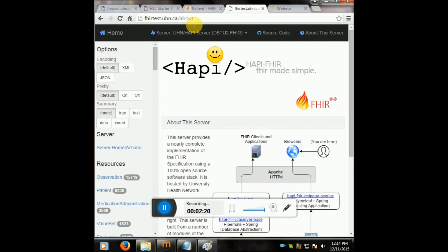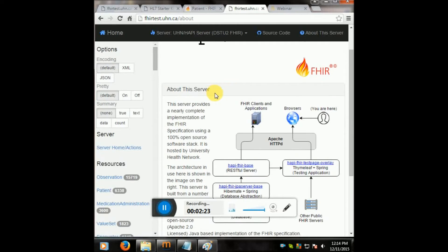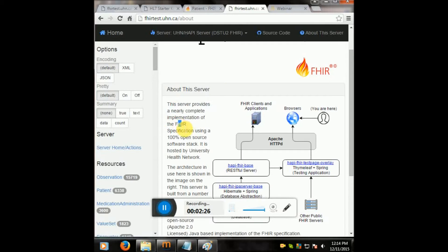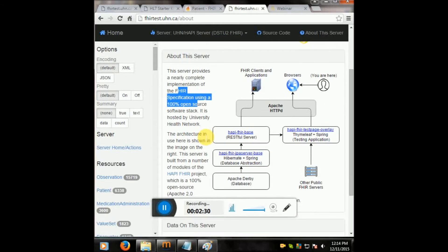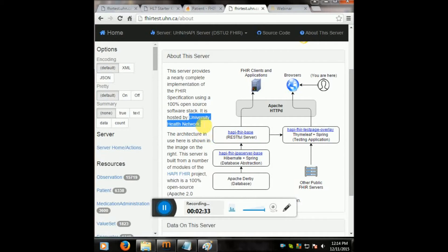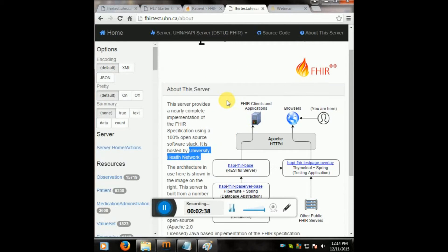But here's the server, this is a free server we're connecting to with Mirth, and it says right here, implementation of the FHIR spec using everything open source. We're able to connect to it and it's hosted by the University of Health Network, so thank you, University of Health Network.